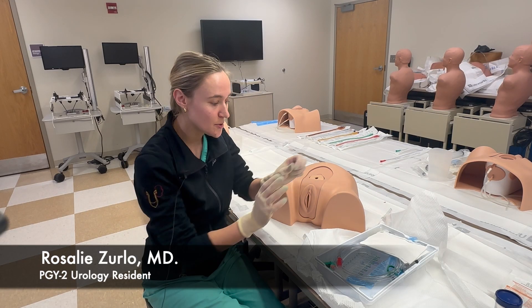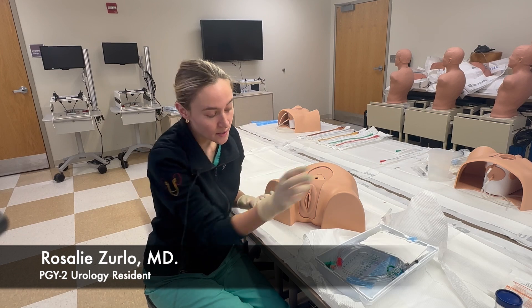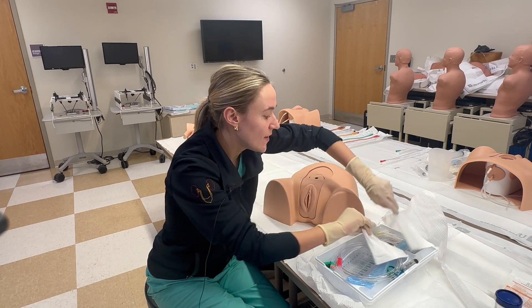The first thing we'll do — we already have our kit open with sterile technique and sterile gloves on — but that would be the first thing you do: grab the sterile gloves from the kit and place them on. The next thing we'll do is grab our fenestrated drape.